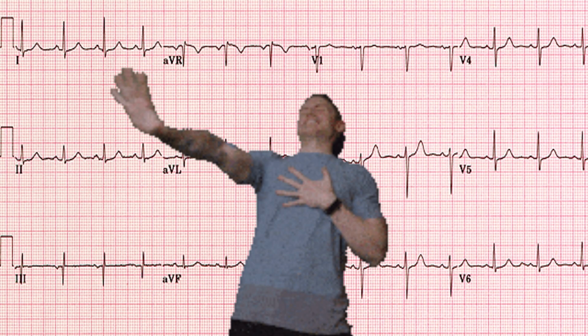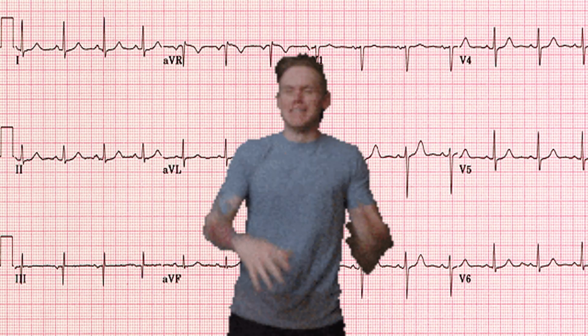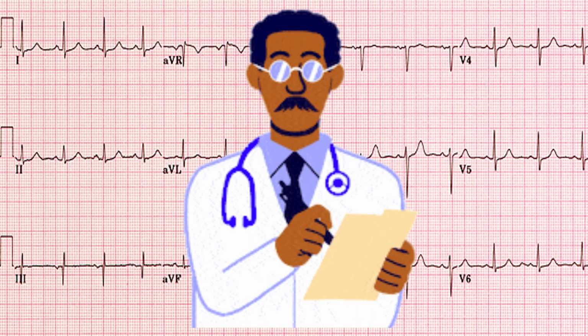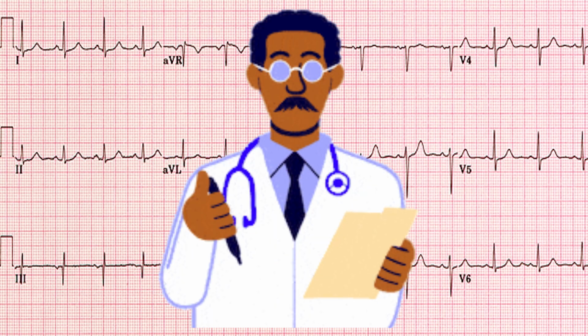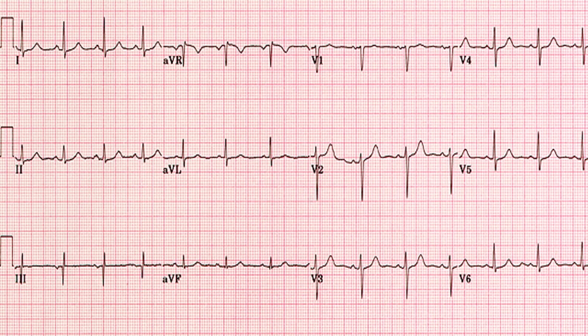If someone comes to the hospital with chest pain or any cardiac problem, the doctor will advise to do an ECG. The nurse or ECG technician will take the ECG. It is also very important to know how the heart function or electrical activity is transmitted and displayed in the ECG machine and recorded as a waveform.